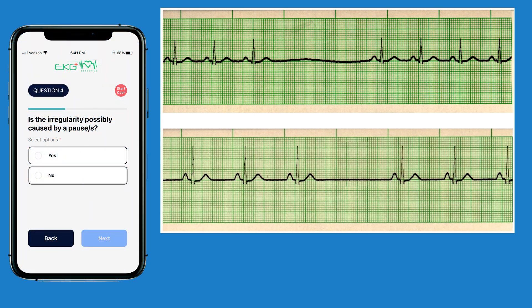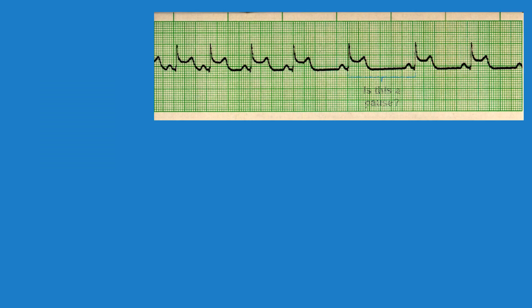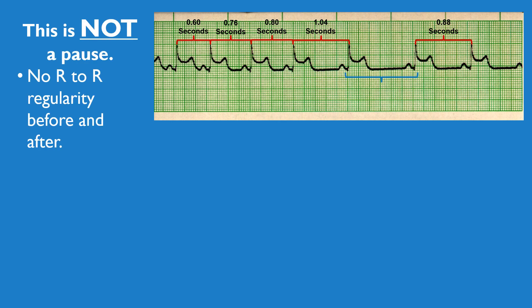Question four asks whether the irregularity is possibly caused by pauses. This can be a confusing area, so let's revisit what constitutes a pause versus what does not. Looking at this ECG, it appears there might be a pause between the flashing bracket. To make that determination, we need to measure the R to R intervals before and after this gap. It doesn't appear there is any consistent intervalling, and when we actually measure the intervals, there is no consistent R to R intervalling before or after this gap. Since there isn't consistent intervalling, this is not a pause — it's just a larger gap within a rhythm that is basically irregular.